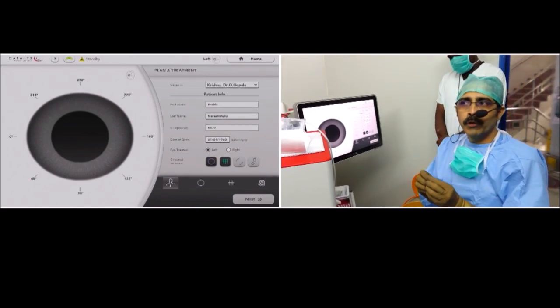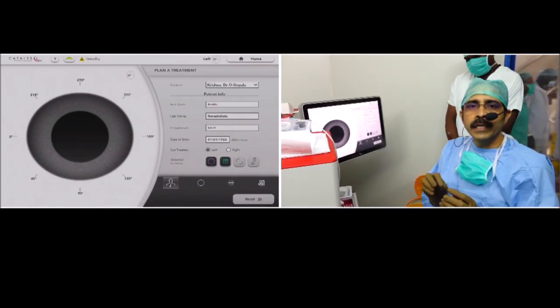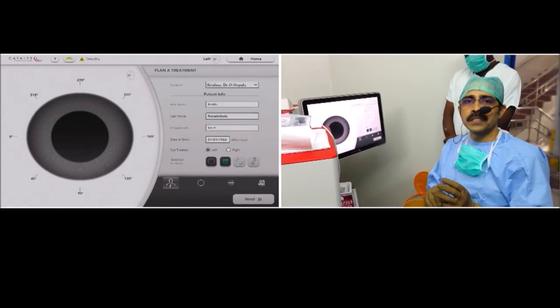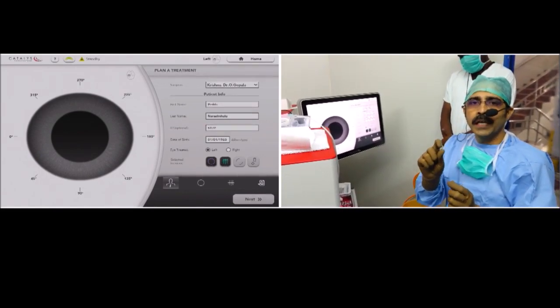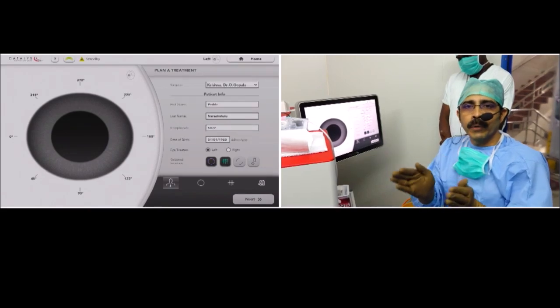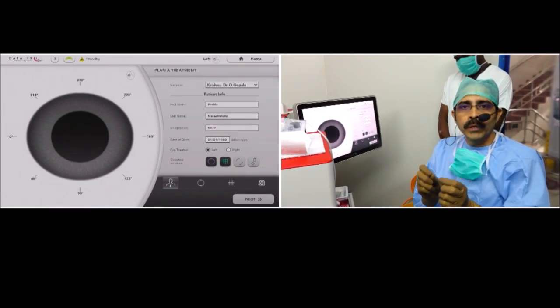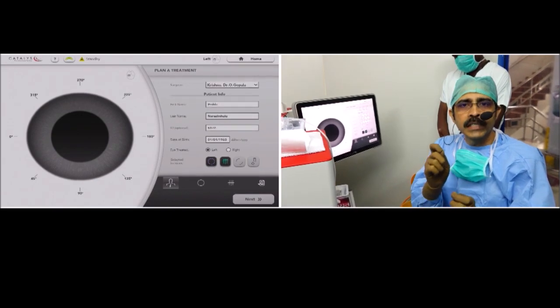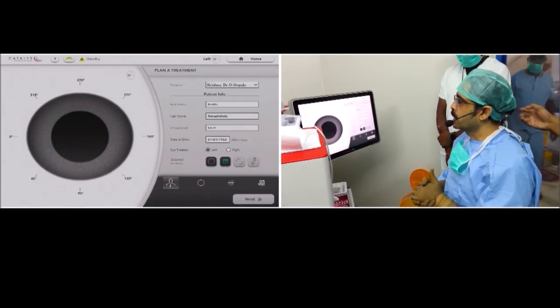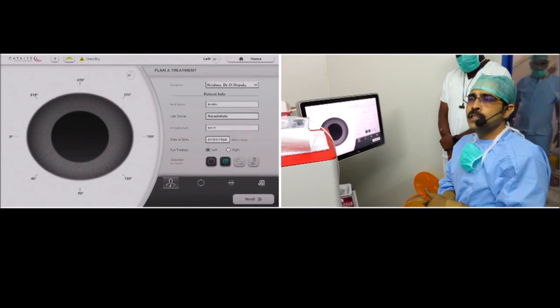The beauty of this femto laser is it will not generate any thermal effect, as in the case of phacoemulsification, because the cavitation energy or cavitation bubble or wave — because of the plasma — expands only up to 100 microns, which is very tiny. The machine we are working with now is the Catalys, run by Johnson & Johnson.